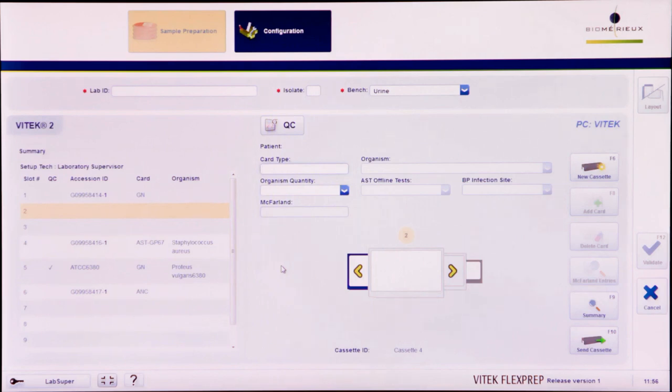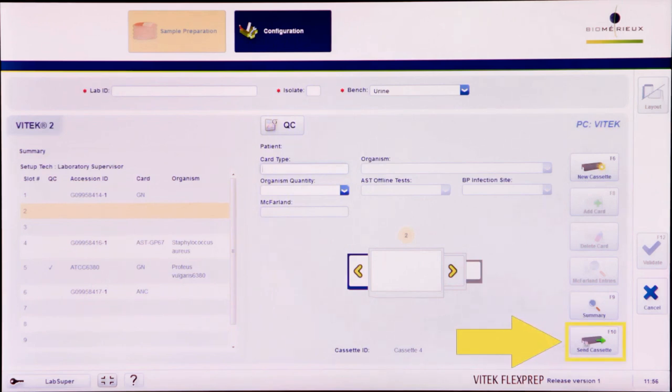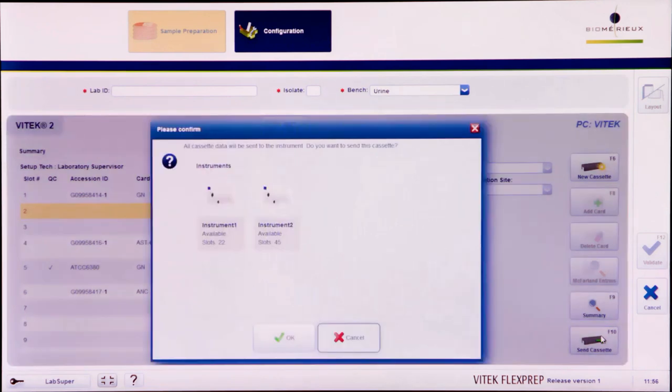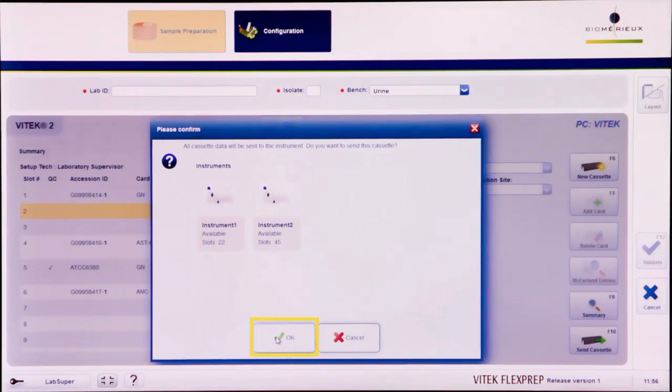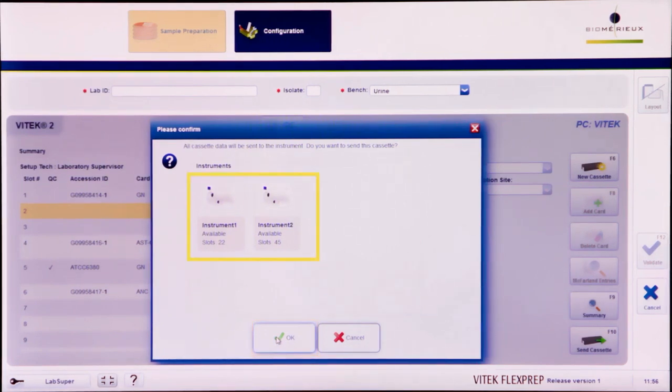Select the Vitek 2 PC. Upon completion of a cassette, click the Send Cassette icon or press F10 to send the cassette to the Vitek 2 PC. A confirmation dialog box will appear. Select OK to send the cassette. The definition will be sent to all of the listed instruments.